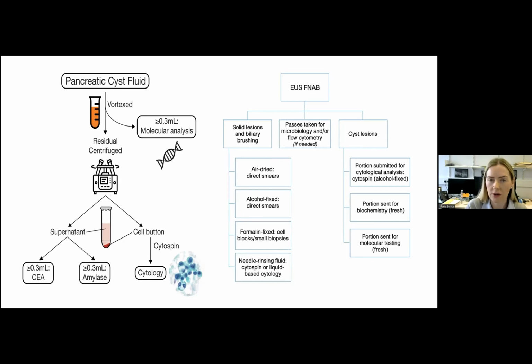So if they don't have enough diagnostic material, we can ask for more material to be provided. And then secondly, it allows us to triage the case accordingly. So for example, in the case of a solid lesion, we'll often have air-dried direct smears and then alcohol-fixed direct smears. And if we have lesional material, we can then ask for needle washings to perform a cell block and immunohistochemistry depending on what the lesion is.